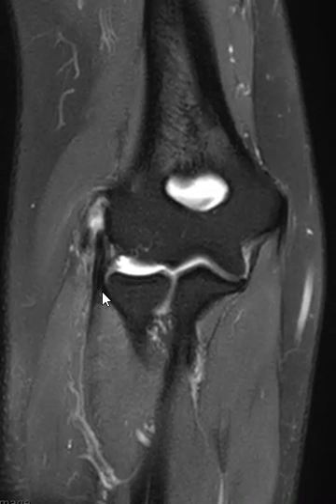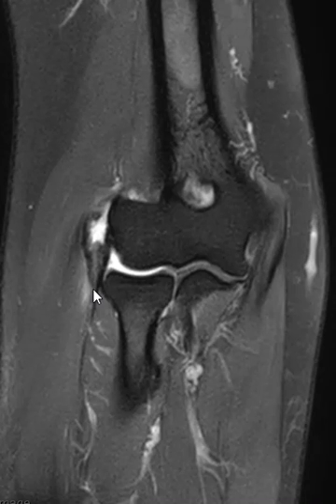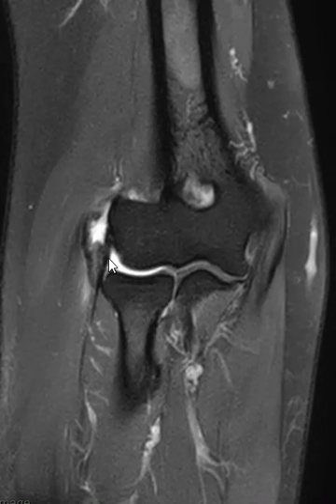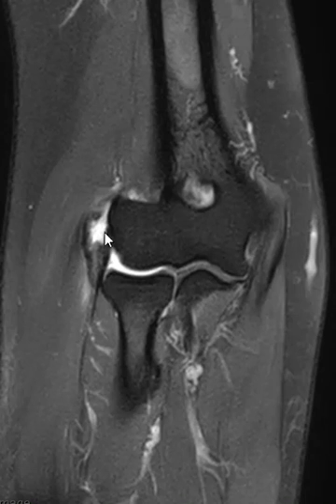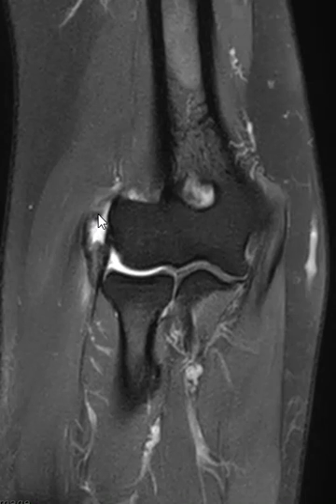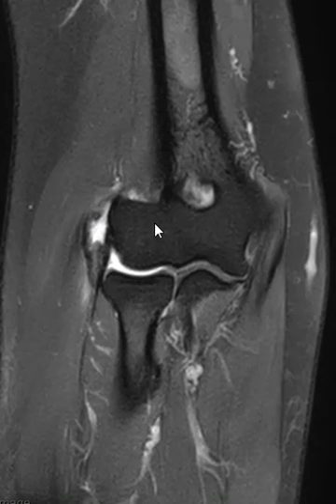These ligaments are deep to the common extensor tendon. Often we'll see this torn along with the ligaments, but in this case it's an isolated tear of the common extensor tendon. Thank you very much.